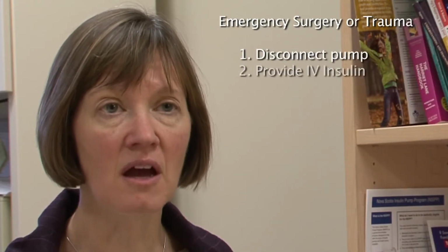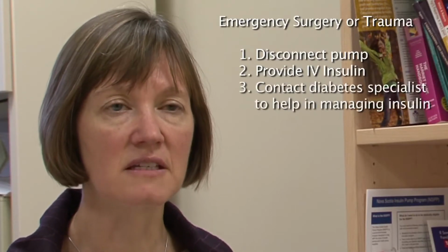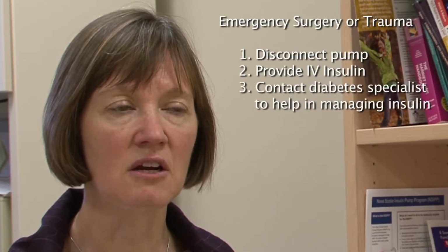For emergency surgery or trauma, these things can't be planned ahead for. So what will happen is the pump would be disconnected and insulin would be supplied by the care team through an intravenous. At this point, it would be important to contact the diabetes specialist, the physician that's helping manage the diabetes, in order to help manage the insulin for that procedure.